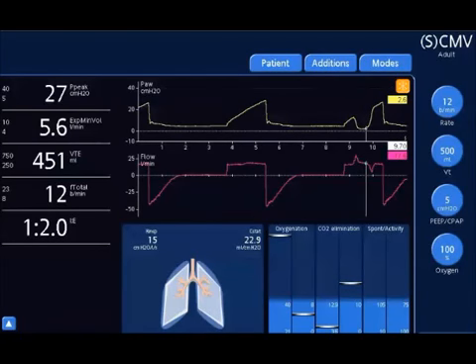This image displays flow mismatch, which is a common ventilator asynchrony in volume control ventilation. This happens when a patient's inspiratory demand is high, usually a result of greater minute ventilation needs, often seen with patients with severe sepsis, or in burn patients also.